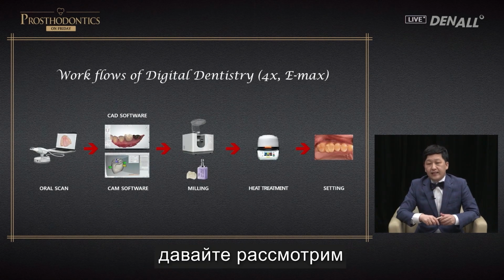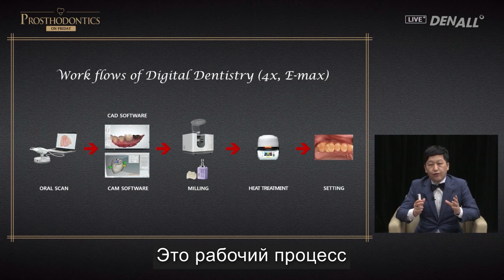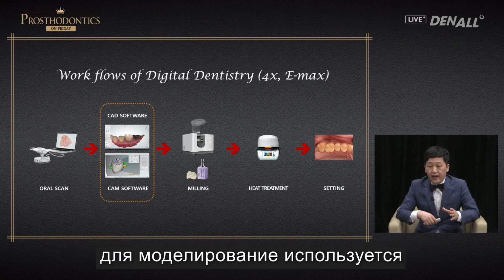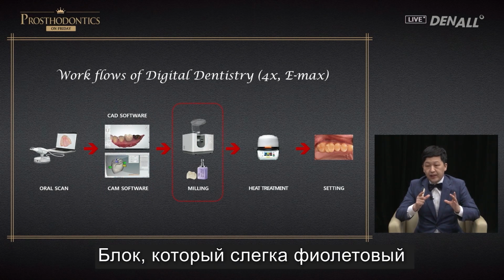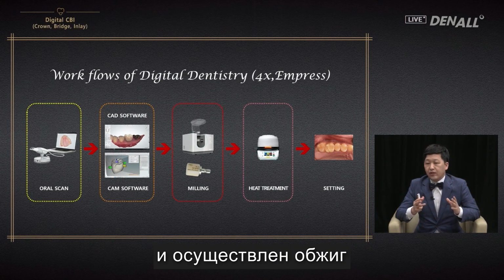First, let's look at 4-axis milling machine using Emax. This is the workflow using digital dentistry. Oral scanning is done. CAD software is used for design and calculation is done with CAM software. And the block, which is slightly purple, is milled and firing is done.